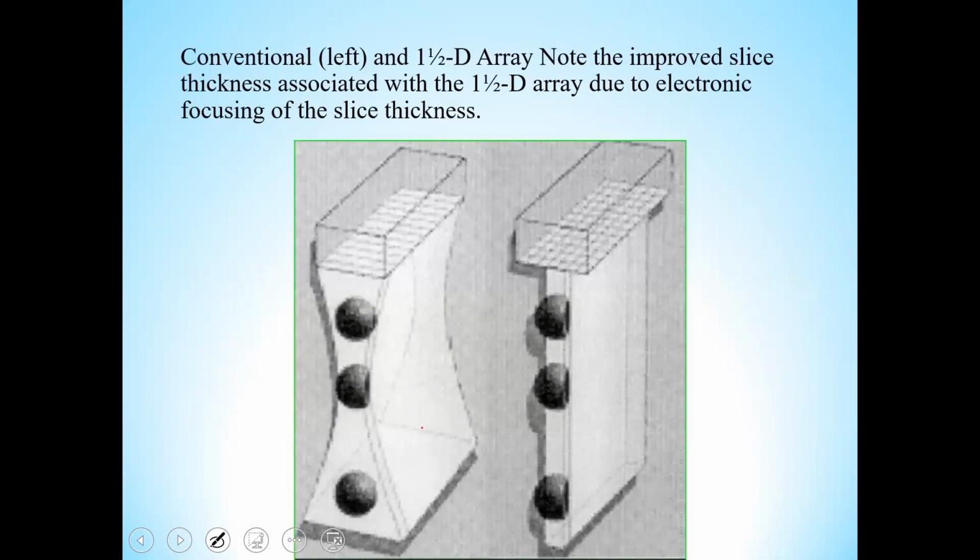Again, you can see in this image. If two structures are placed over here, they will appear the same, they will not be separated from each other. But if the same distant structures are placed over here, only one of the structures is occupied by the beam at a time, and that's why they will be separated from each other.